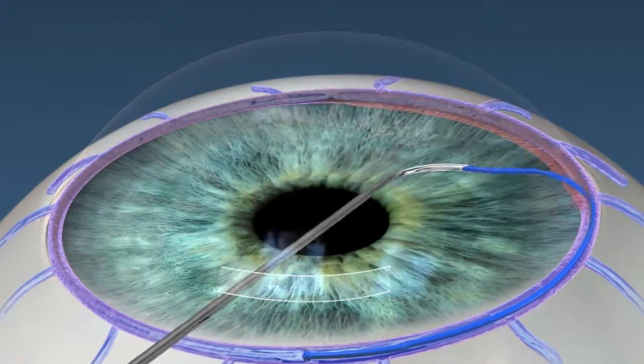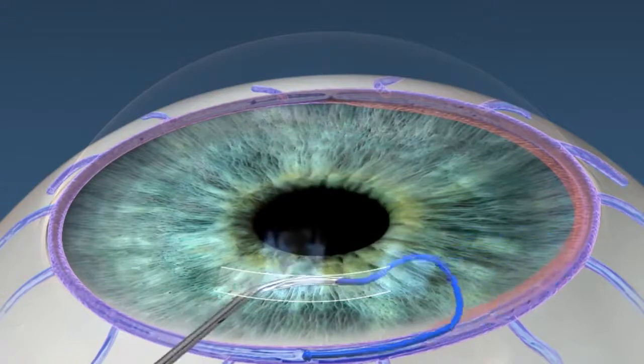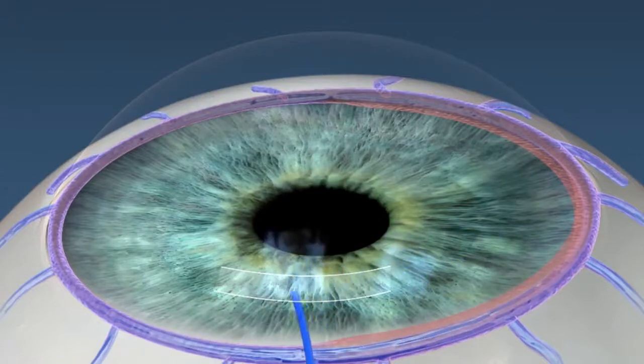You can also determine how much medication reduction you want to get with your patients. Another key benefit of this device is that we're not leaving an implant in the eye, which can come with its own set of complications.